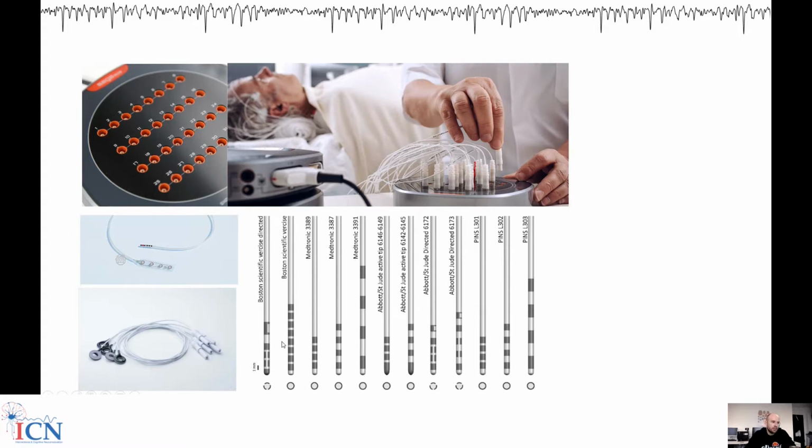And the other thing is that even if you have just 4 ring contacts, so not segmented, depending on the actual size and spacing of the contacts, you will cover a completely different amount of neural tissue. So the signal that I get from these adjacent contacts will be smaller in amplitude, but also more focal in tissue when compared, for example, to these, I think they are for spinal cord stimulation, large contacts with their spacings.